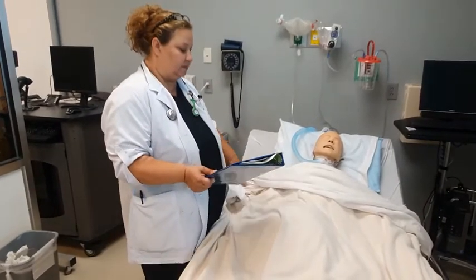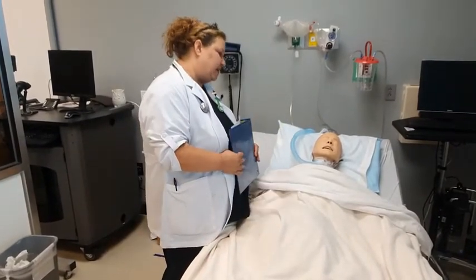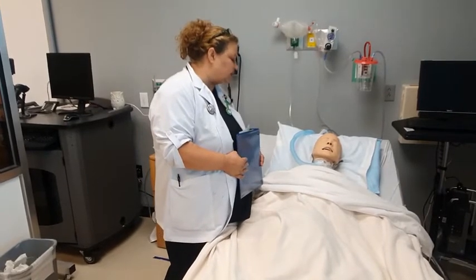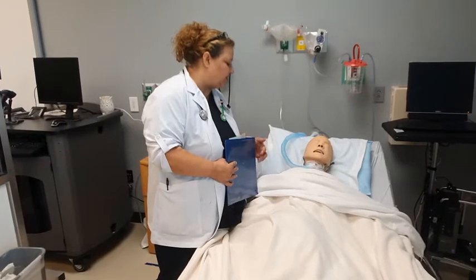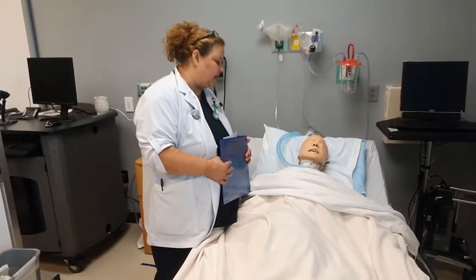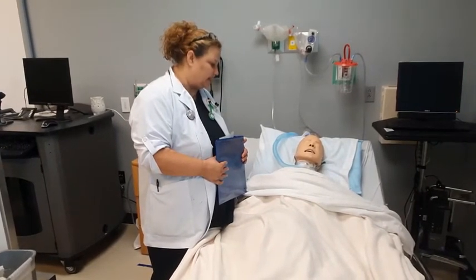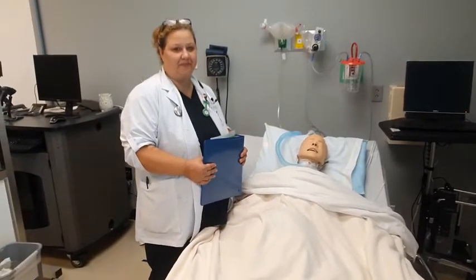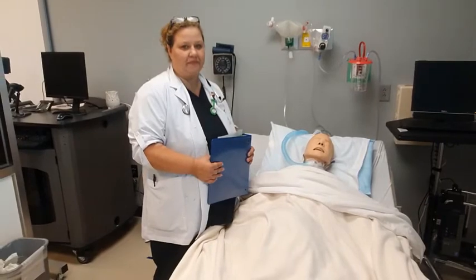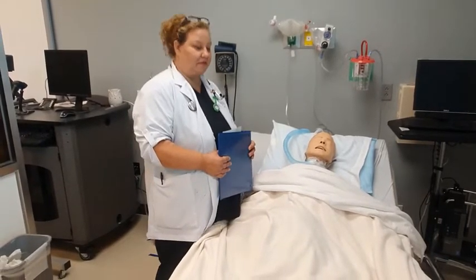Explain the procedure to your client. Mr. Smith, I am in need of doing some trach care on you today. There's a little bit of drainage around, and it is time for me to do that. So I'm going to go gather my supplies, and I will be back. Assess their respiratory status: shortness of breath, coughing, their rate, skin color as well.